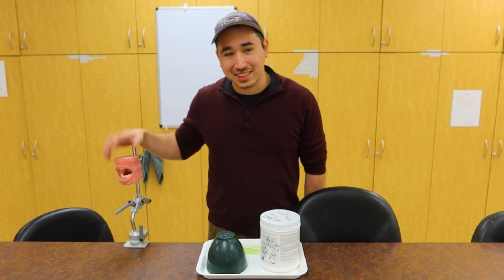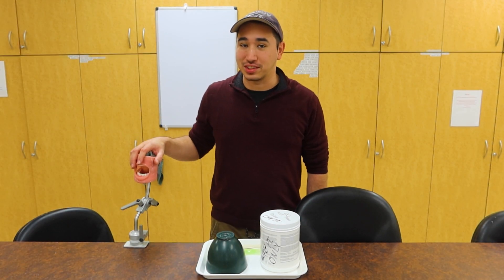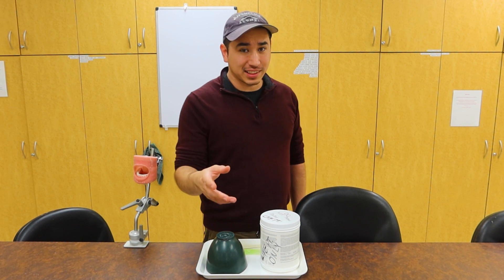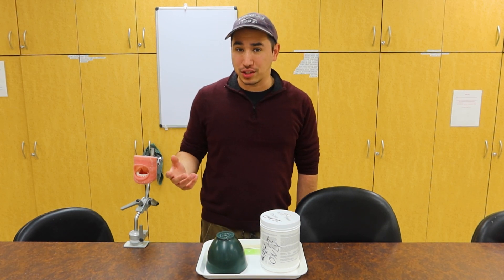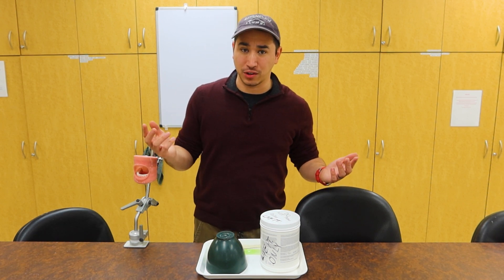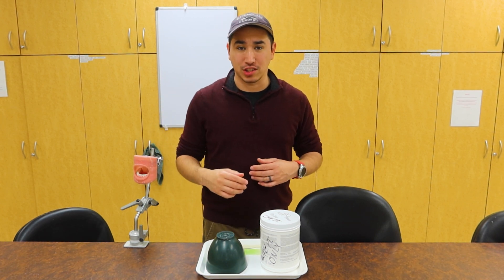Hey there, welcome back to DentalThings. Today we're going to be learning how to take good impressions. You never want to have a negative impression on someone — well, at least in dental you kind of do want to have a good one though. We're going to learn about all the components that we need, how to take an impression, proper mixing techniques, and also how to work with the patient.